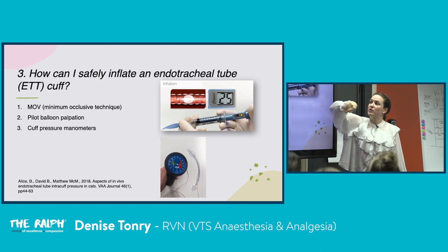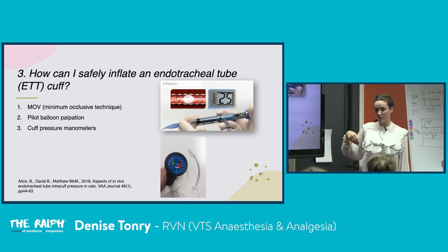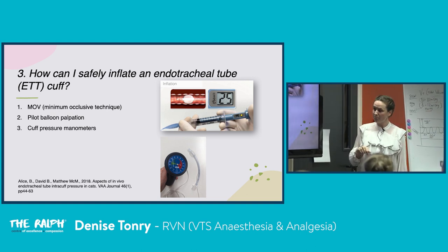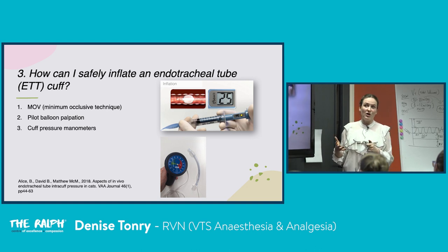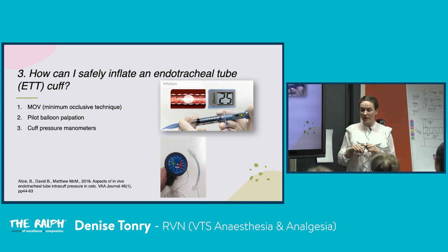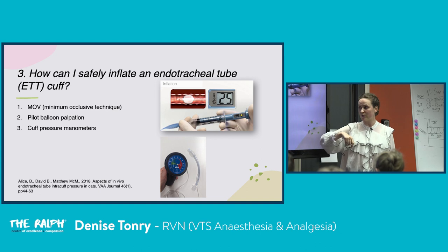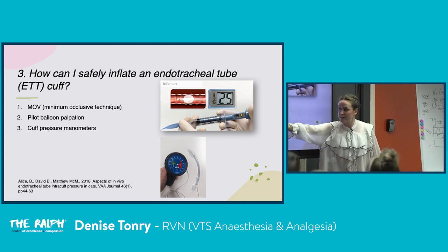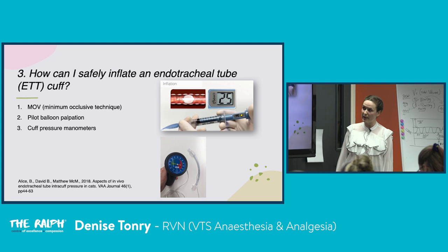If for some reason you're experiencing a leak at this point, you need to potentially increase the size of the endotracheal tube as opposed to keep inflating the cuff. Again, another patient that this really benefits is cats, because they have very sensitive tracheas, and often people are nervous about using cuffed ET tubes. I don't know at what point they stopped using uncuffed ET tubes, but certainly in the referral practice I've worked in, in anaesthesia, they use cuffed ET tubes. So I'd prefer to provide a safe way of inflating the cuff and go forward that way. Usually with cats, we go more towards 20. Again, everything's just lower: 8 mils per kilo, 8 on the PIP, and then 20 on the cuff pressure manometer.